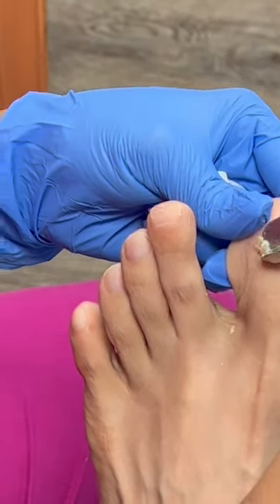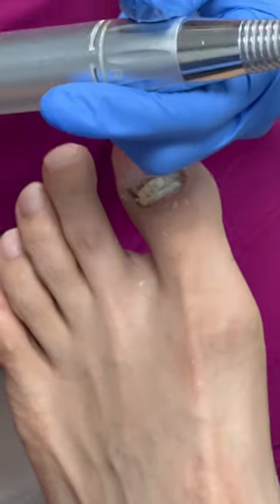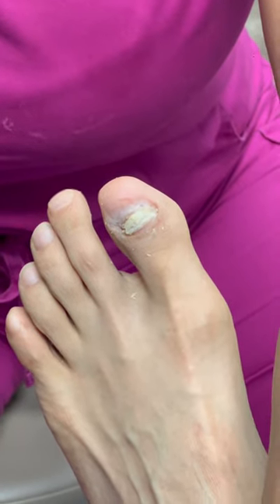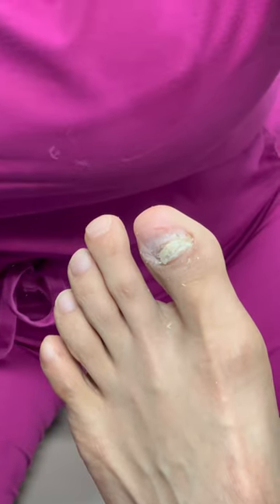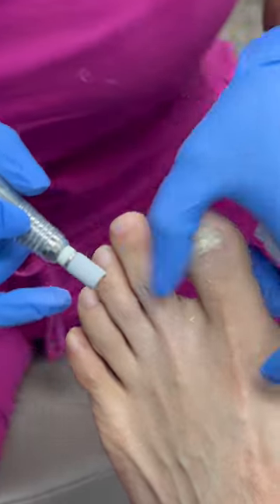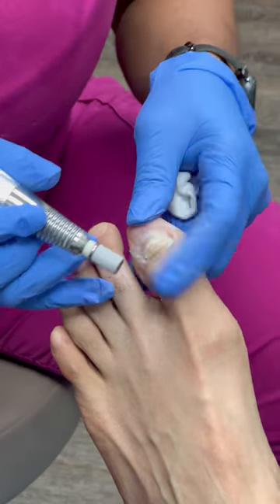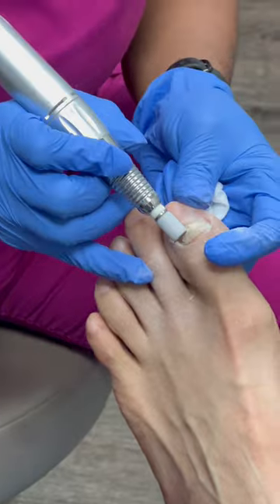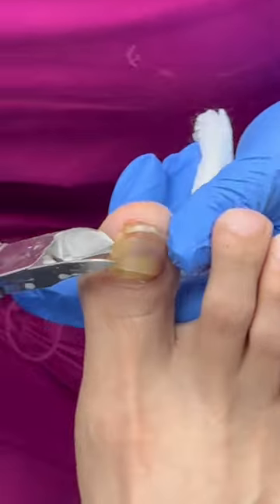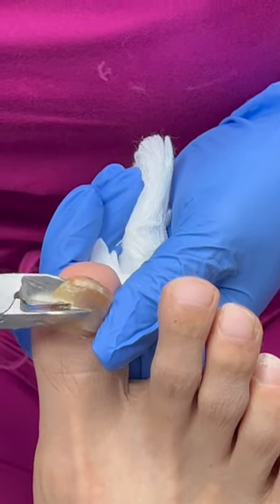All right, so I'm just gonna burn it down. This shouldn't hurt — it may just tickle a bit. You can see how far... just let me know. That's that first scallop.